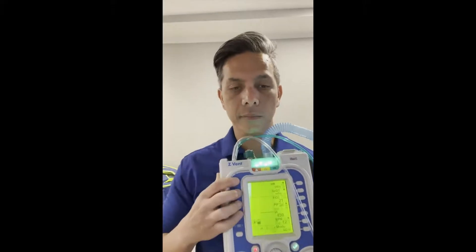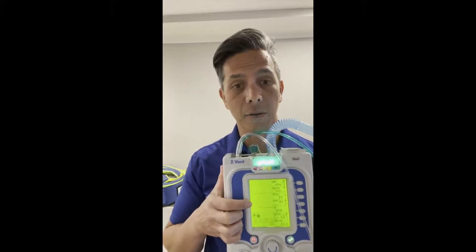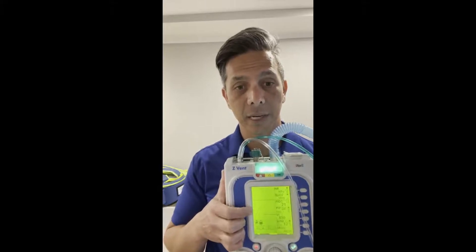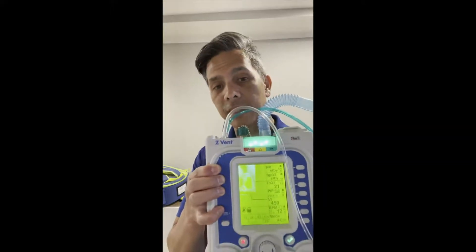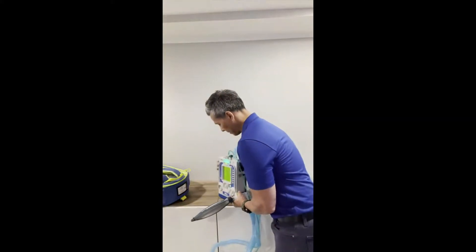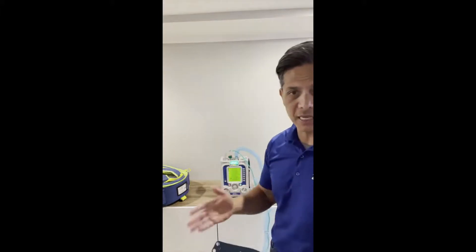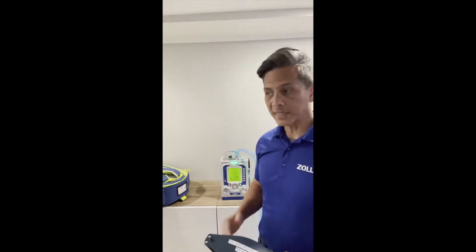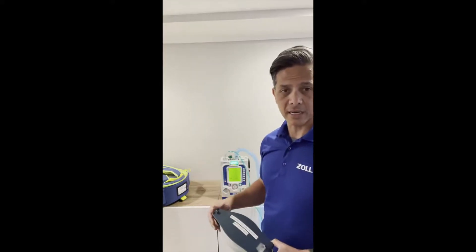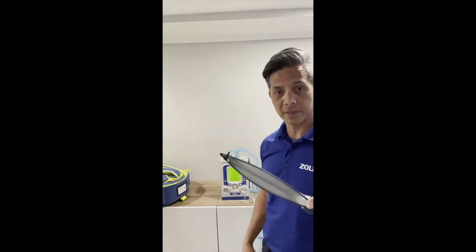This ventilator also has a pressure-over-time waveform, which tells you if you have synchrony issues, trigger issues, if the patient is over-breathing, or if you're auto-PEEPing. It addresses concerns around barotrauma and volutrauma. This is a full mechanical waveform. Right now it's in assist control. To make changes, I dictate the volume — going from 450 up to 510. Zoll believes in 6 to 8 mL/kg as an industry standard. To change a value, you just touch, turn the dial, and confirm with the check mark.